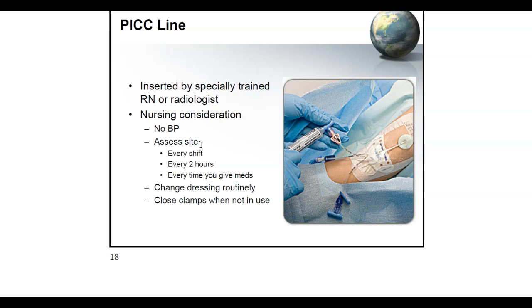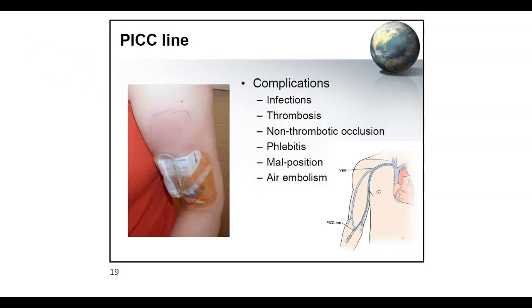Now, after you're done using the PICC line, make sure you're closing the clamps when you are not using it. All right, some complications. Like with anything invasive, there is a potential for complication. For the most part, if we are following policies, protocols and guidelines, and really assessing things and taking care of it, we're able to prevent most of it. But there are times that you can't prevent it 100% of the time. So unfortunately, sometimes patients can develop complications.